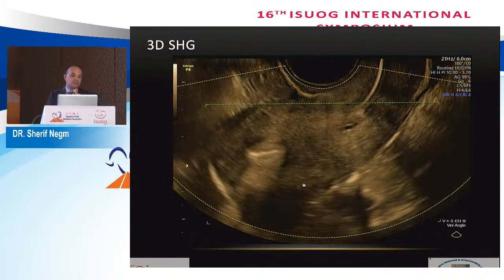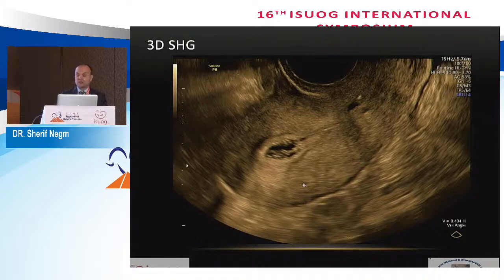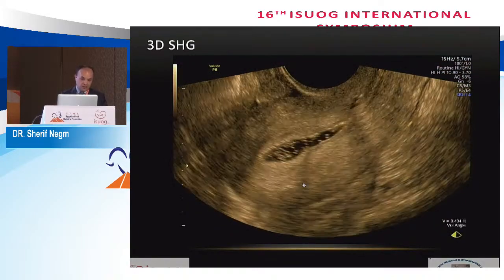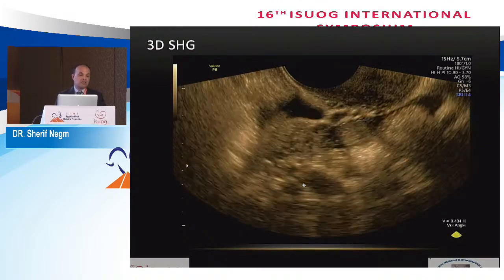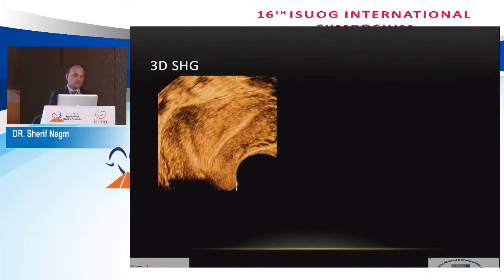Sometimes you get a patient that needs examination of the uterus for Mullerian anomalies, and the patient is not at the optimal time in the menstrual cycle, in her late luteal phase, but rather in the early follicular phase. For that, you can use sonohysterography, whereby you inject some saline in order to get a good delineation between the endometrium and the myometrium. You can see here that the endometrial cavity is very clearly delineated using the saline rather than depending on the thick endometrium.